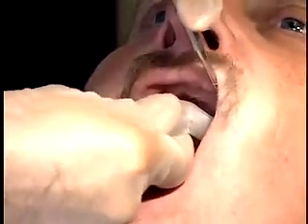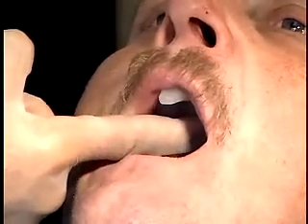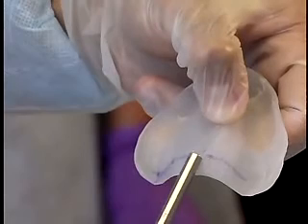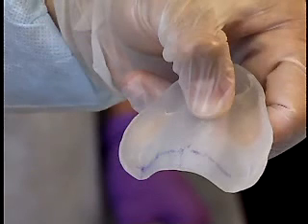Insert the dried maxillary custom tray into the patient's mouth and fully seat it. Remove the maxillary custom tray. The indelible marker may have transferred to the custom tray. If the line has not transferred to the custom tray, reinsert the tray and instruct the patient to blow through his nose while you gently pinch it shut. Look in the patient's mouth. You may be able to see the indelible marker line through the translucent tray.